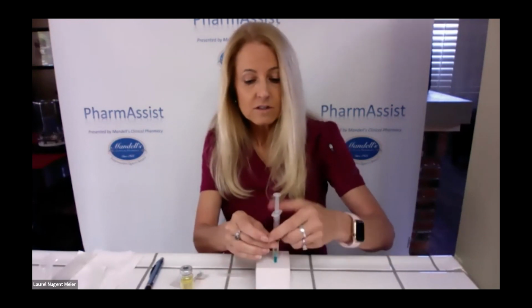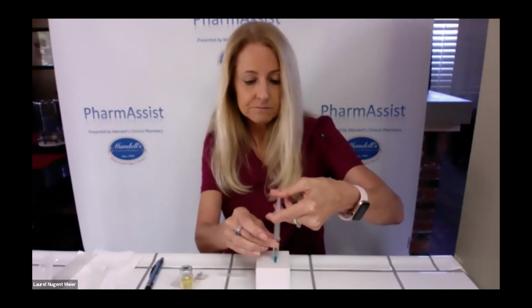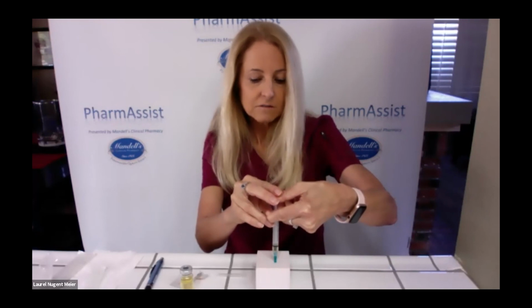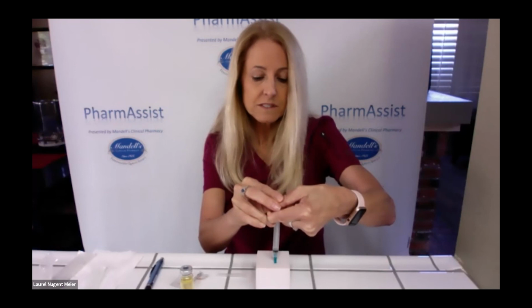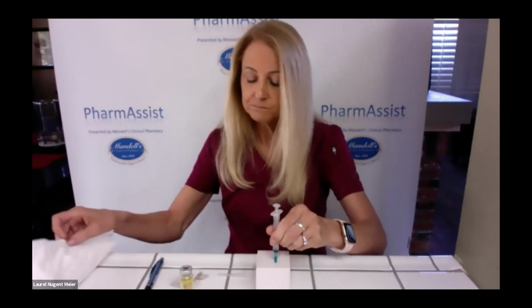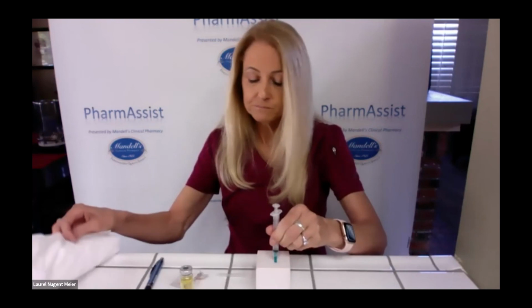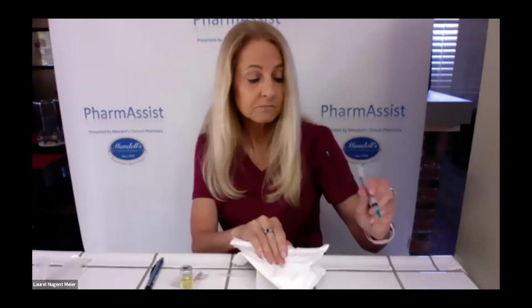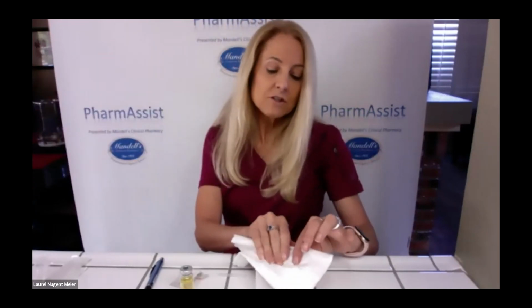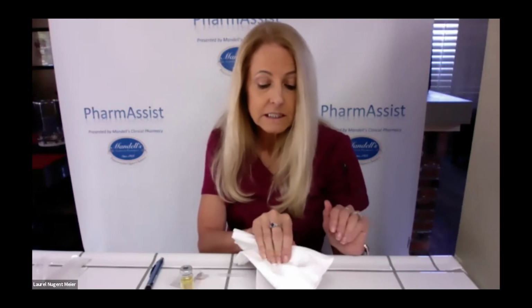So you'd go in like a dart, you'd inject, and it's going to take a little bit of time, so just push fairly hard. It's a skinny needle, and you've got a thick oil base. Once it's already injected, wait about a minute, 30 seconds, and then pull straight out with pressure. This will go in the sharps container, and you're just going to hold for about a minute. Keep the weight off of your muscle, off your leg, and then check.